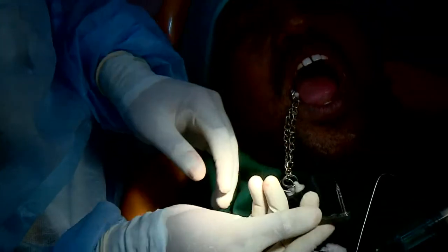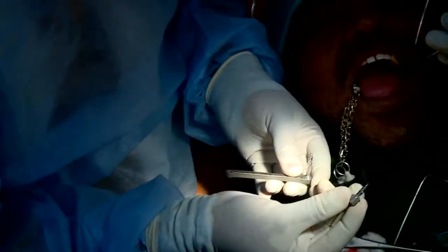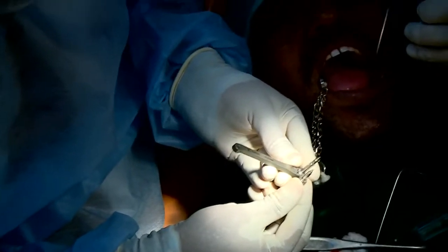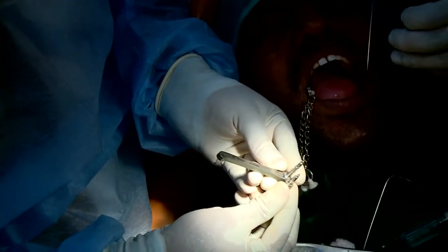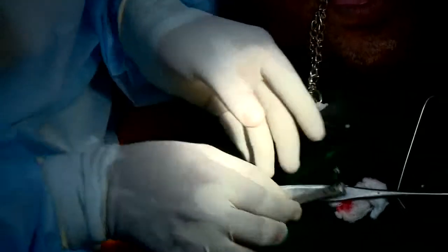So this is a longer one. We also have a slightly shorter implant driver. So you can see that the implant driver comes in the regular sizes, 2 sizes. I am going to go for the longer one for the time being. So now my doctor is going to give me the implant transfer either way.